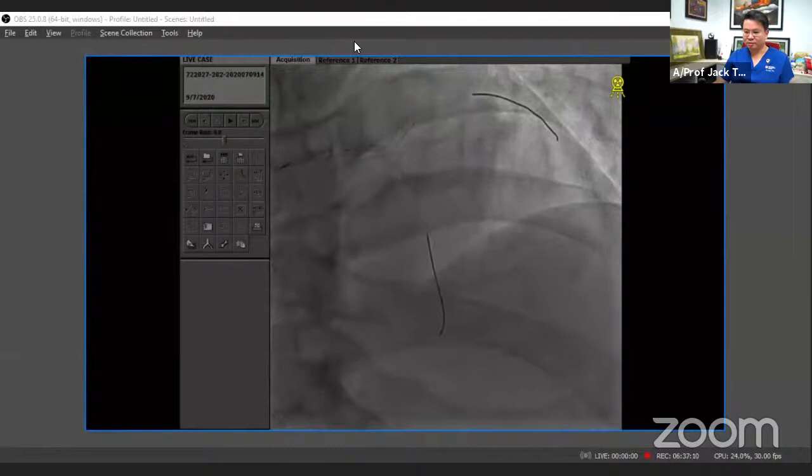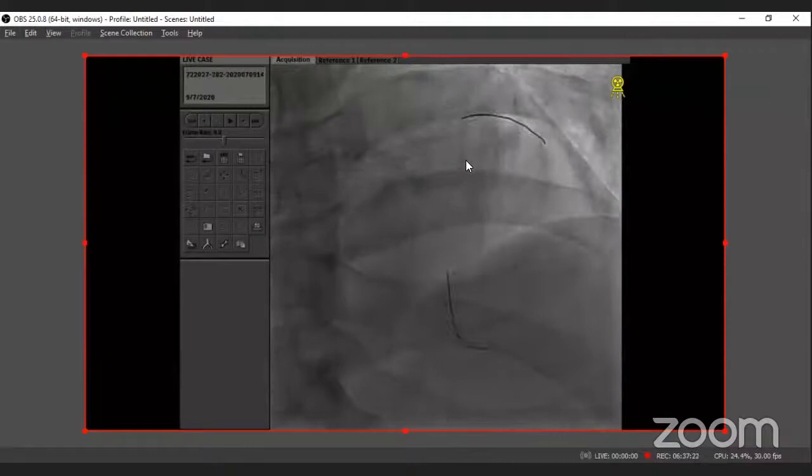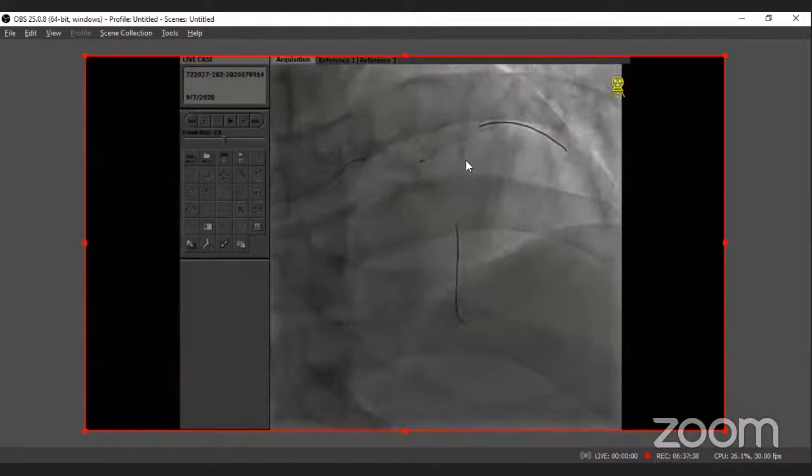So the LAD looks acceptable, and we are trying to push down the IVUS to the Cx. It looks like it's not crossing. Yeah, maybe so, because of the angle. I wouldn't try too hard, Aaron. Yeah, correct. Okay, so I think we will just show you the IVUS for the LAD, and then we're probably done here.